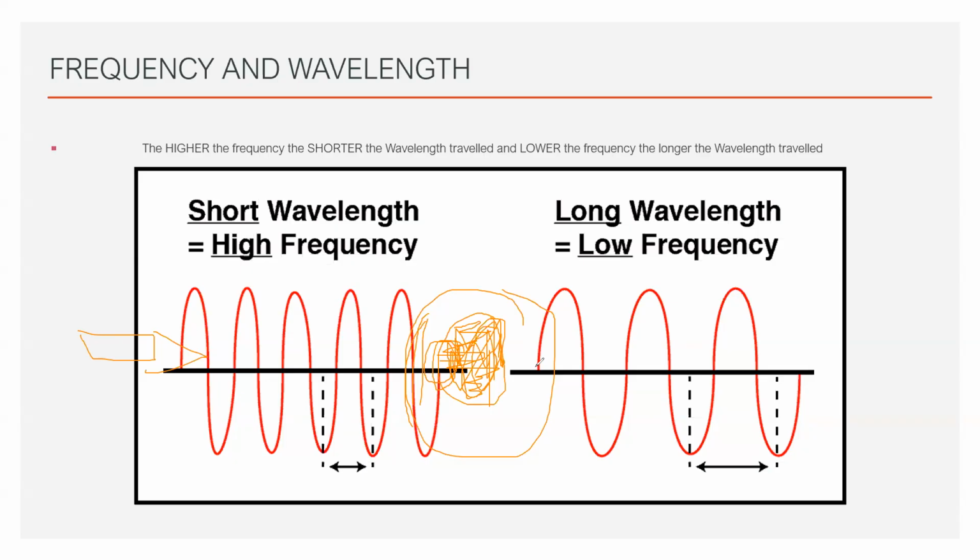of up to 8. And for meninges, actually using a linear probe with a frequency between 12 to 14 gives you a very beautiful delineation of dura and pia matter. It gives you a very nice view of the extraaxial space. And in particular, if you want to see a collection in the extraaxial space, any brightness, a linear probe might be better. That being said, we all have limitations.